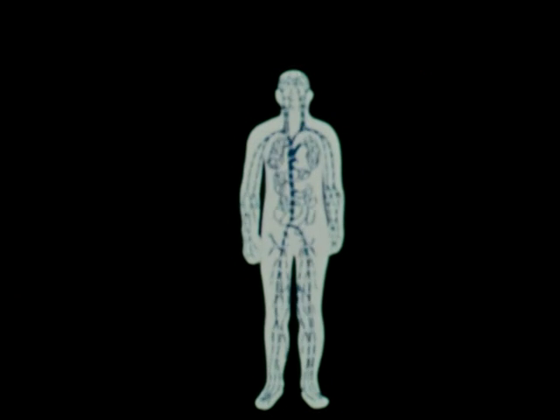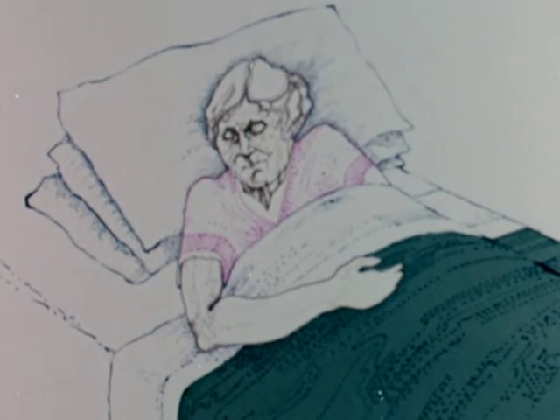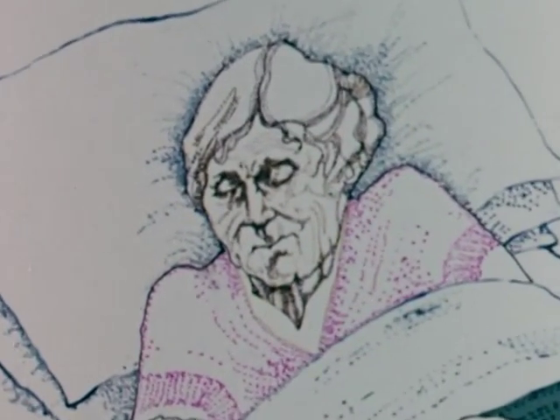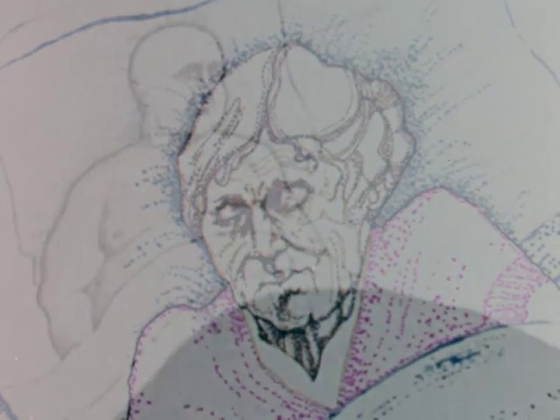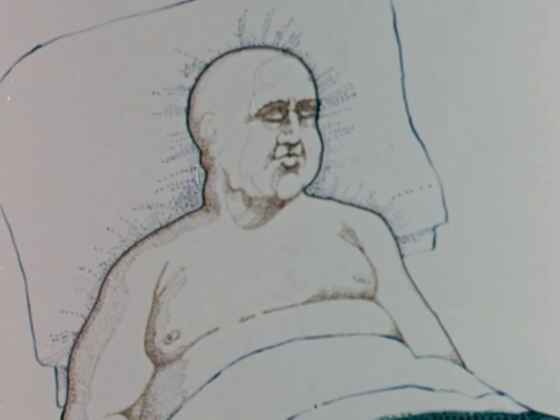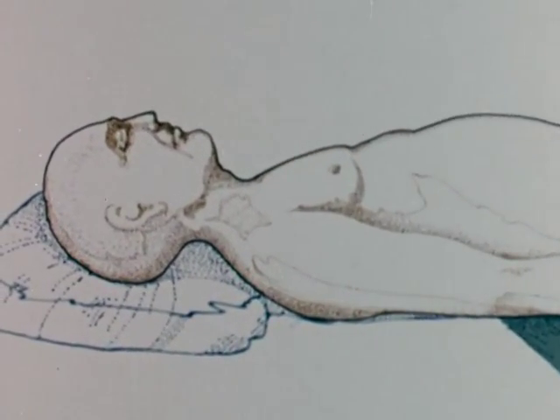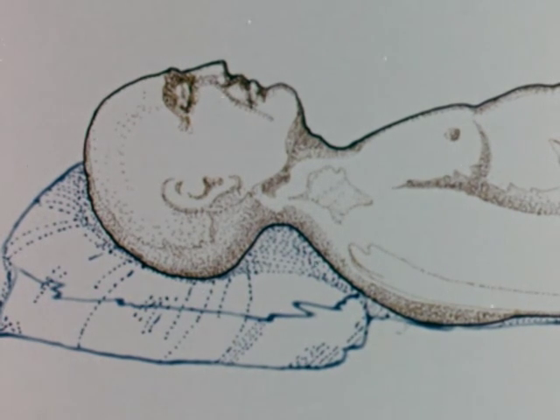But there are 4 groups of patients whose veins are notoriously difficult to cannulate. First, the infant. Here, the veins are obviously very small, and it's often more practical to enter by the scalp vein, a process which is now much simpler than it used to be. Secondly, the geriatric, where the veins are tortuous and fragile, and the skin has lost its elasticity. Thirdly, the obese, where superficial veins are small and scarce. And finally, for obvious reasons, the vasoconstricted patient. Clearly then, site selection is determined by the condition of the patient and the purpose of the intravenous procedure.